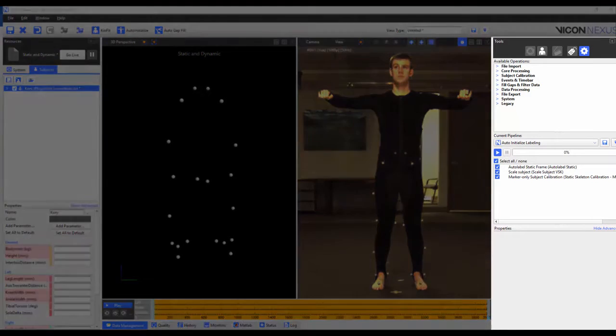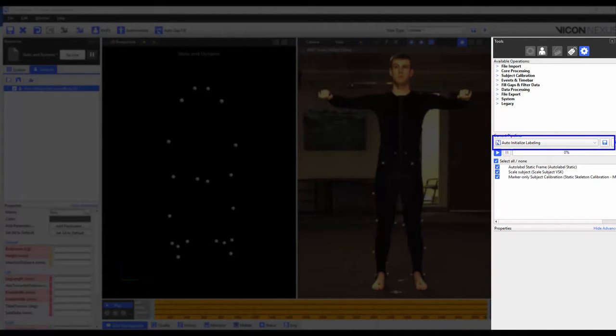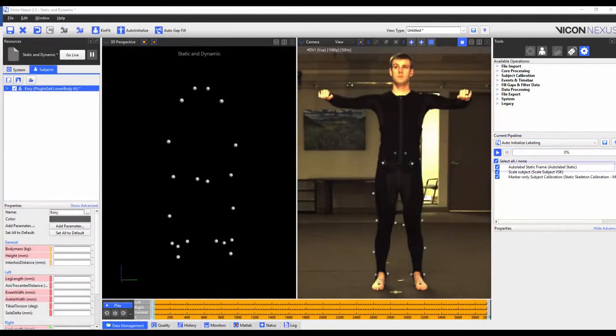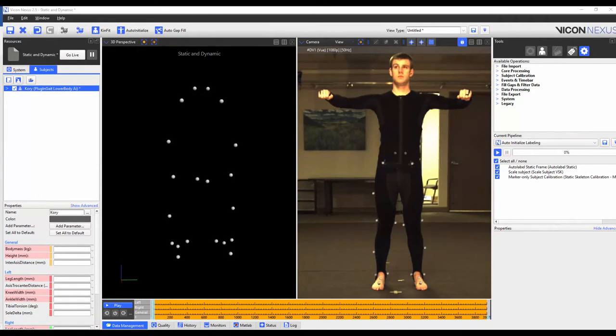I'm then going to make sure that I'm in the tools pane pipelines tab and to make sure that the auto-initialized labeling pipeline is loaded. The first operation is to auto-label the static frame. Because we have extra markers this may not work, and so I'm going to execute this operation by itself to make sure that all the markers are correctly labeled.